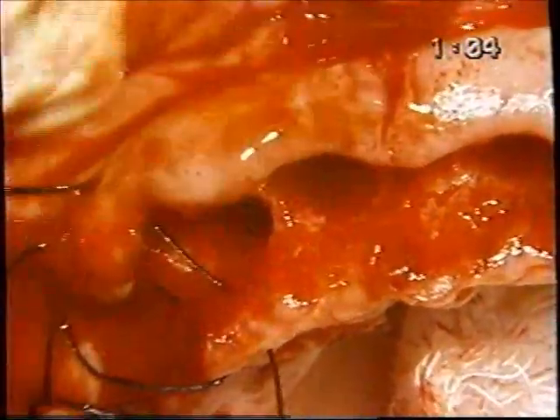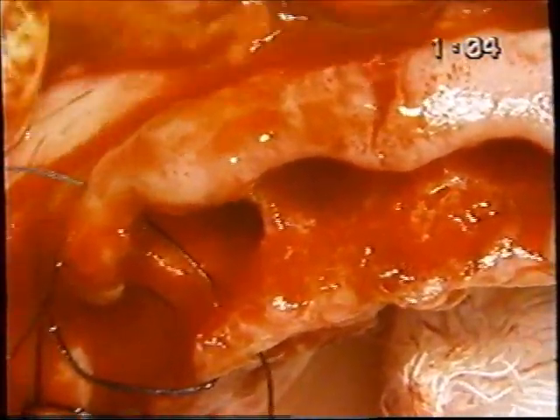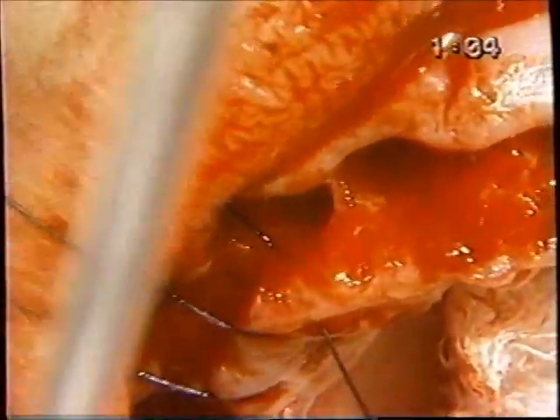The rule of thumb is to put one between each, the papilla area between the teeth. Okay, let's pull that out and do the locking. So, yeah, we try not to put them straight over the socket, of course, but in the papillae areas. Here we're turning the corner. I put in an extra one.